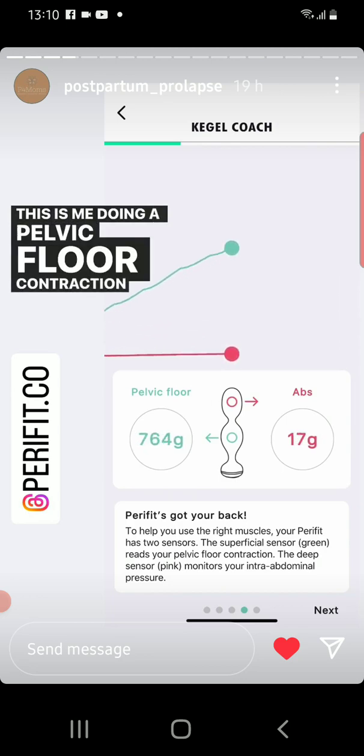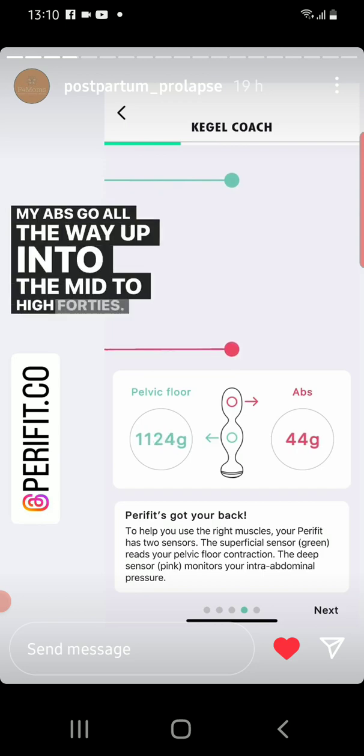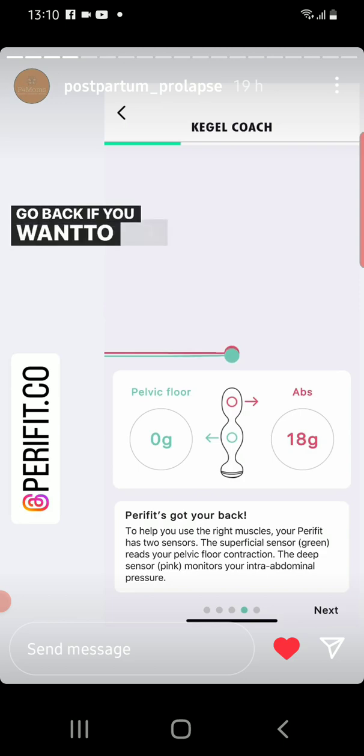This is me doing a pelvic floor contraction first and then bearing down at the end. My abs go all the way up into the mid to high 40s. That didn't happen on the original one — go back if you want to see it.